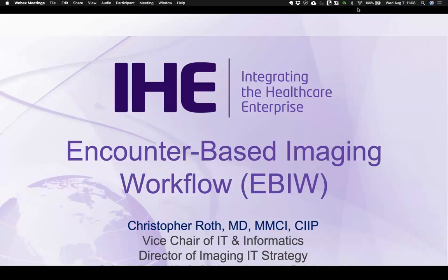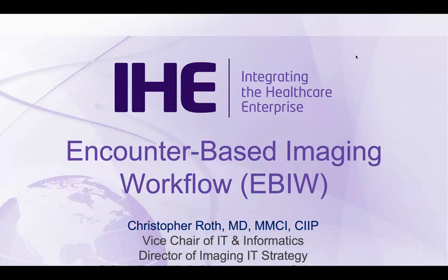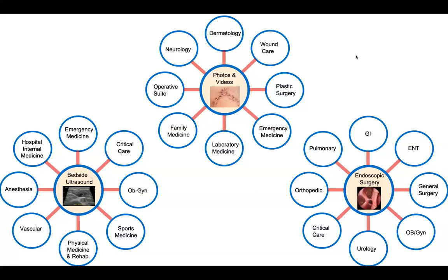If I were to summarize it in a sentence or two, we basically want to capture clinical multimedia of various flavors that we don't want to have to put an order in to associate the images to, and the reasons are several. It can be really hard to define what body part, what specific configurations of details you want the orders to relate to. All those different things that orders get really clumsy with, you don't want to have to deal with. And in many cases, the spectrum of the different multimedia that we are capturing doesn't lend itself well to an orders-based workflow.